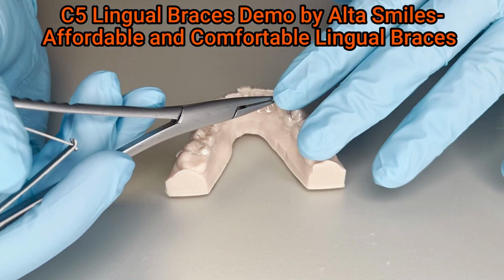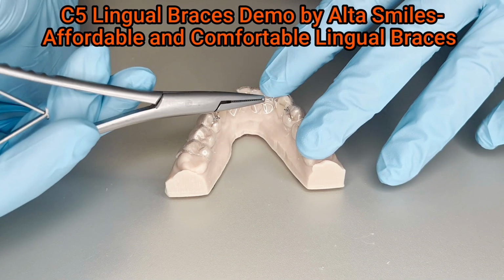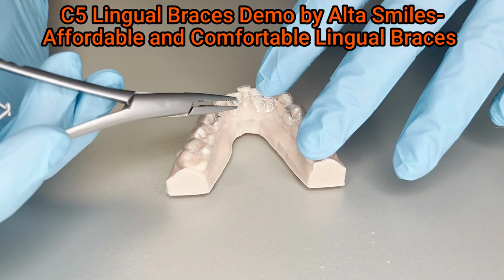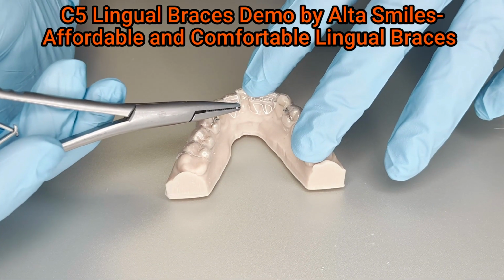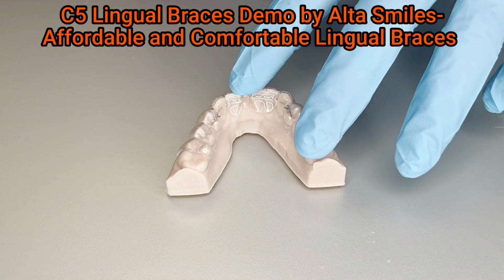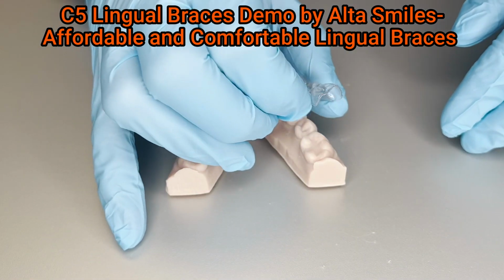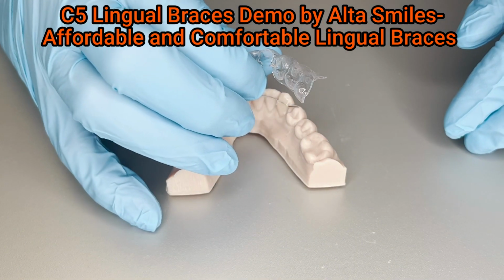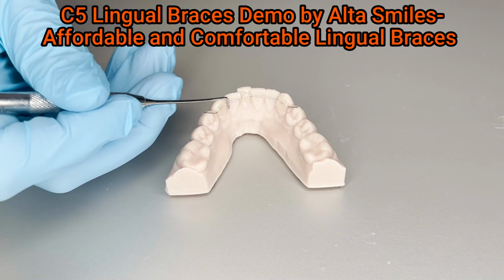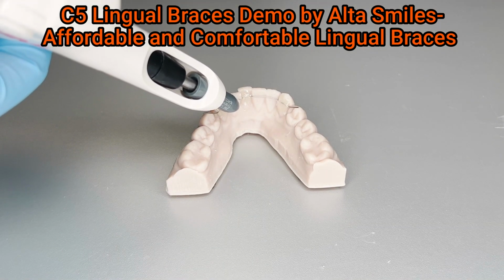Remove the tubing that is holding the ProWire in the tray by grabbing the long end of each tube with a Mathieu plier and pulling lingually and incisally. Hold the posterior portion of the tray to ensure it remains seated during this process. The terminal tubing does not have to be removed. Remove the indirect bonding tray, starting with the posterior and working towards the anterior. Adapt the wire to the lingual surfaces of the remaining unbonded teeth. Cover the wire with composite and cure it.